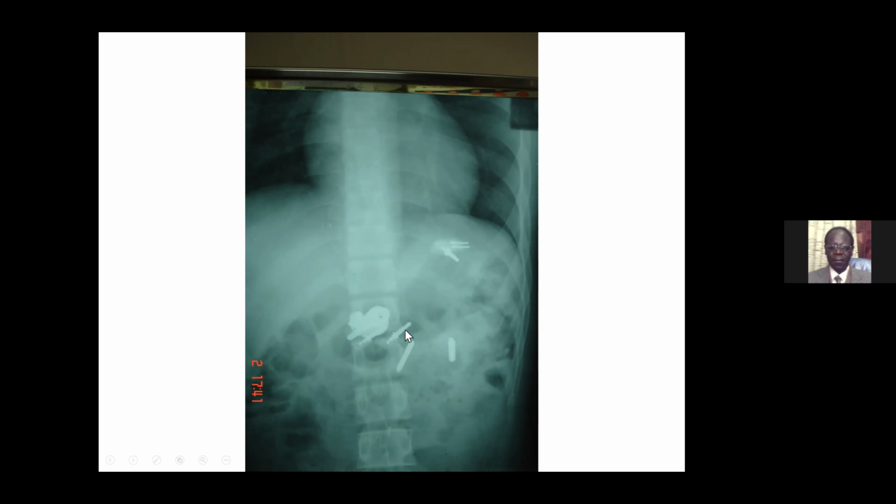There are some objects that are used to seal the valve. These are what is being demonstrated. So this means that it has already passed the esophagogastric junction, which is the narrowest part of the entire GI system.